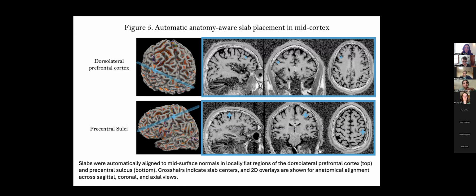Which is a nice advantage, right? Because you have a GUI available and you can basically pick those areas interactively. Whereas on Mars you wouldn't have a GUI, right? You can have standardized automated processes.